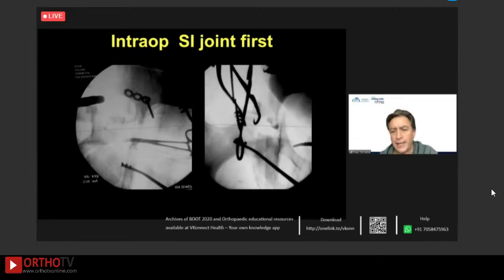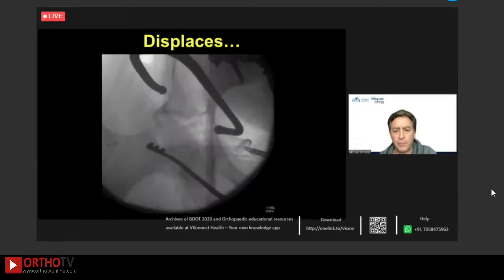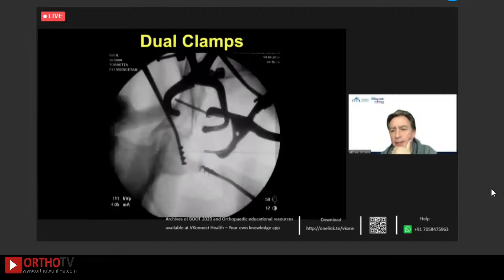And then I'm going to try to get this transverse reduced. And again, you've got this plane. The problem when you put a clamp on and push it this way is it tends to slide. So these very oblique ones on the AP radiograph with that quite vertical axis, you put this clamp on or a collinear clamp or something else, and you can see that fragment that Hassan was talking about is now lateralized compared to the roof, what it's supposed to be next to, right? It's shifted this way. And that's a tough thing to control through just an anterior approach. Like if you're in the modified Stoppa, the AIP, you're just pushing over, which makes it worse. So this clamp, to me, I always end up having to put a second clamp.